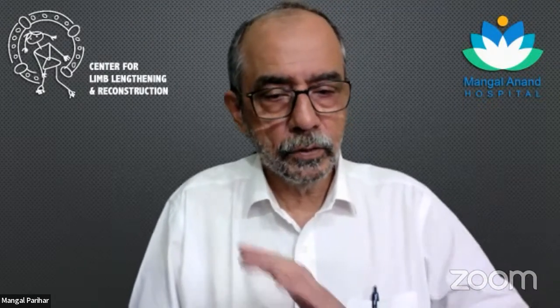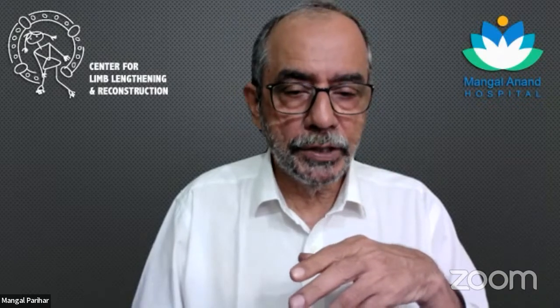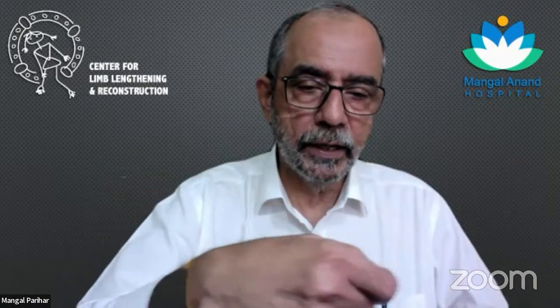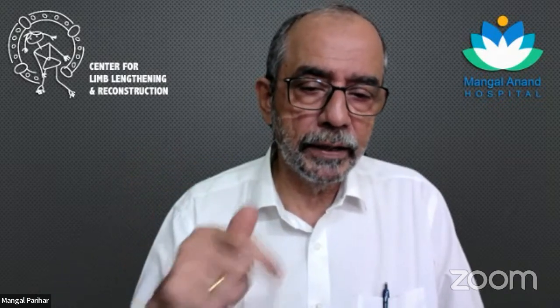So when you do it with the plate, Mangal, what is your take? I slide the periosteum right down so that it is lengthened, just like we do in a TKR. That is mainly so that I can move it behind enough to get my Hohmann's in without struggling. Then I'll do the open wedge, and I will feel the inside, and if I feel any tightness, I'll do pie crusting. In a couple of cases, I have not hesitated to divide it completely when I was still finding it tight.